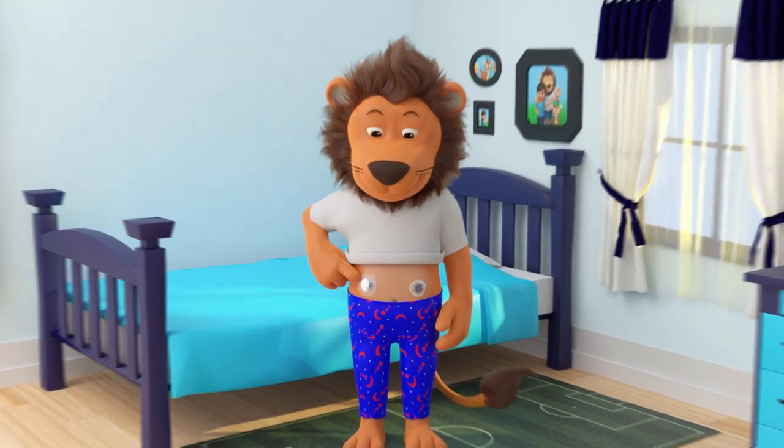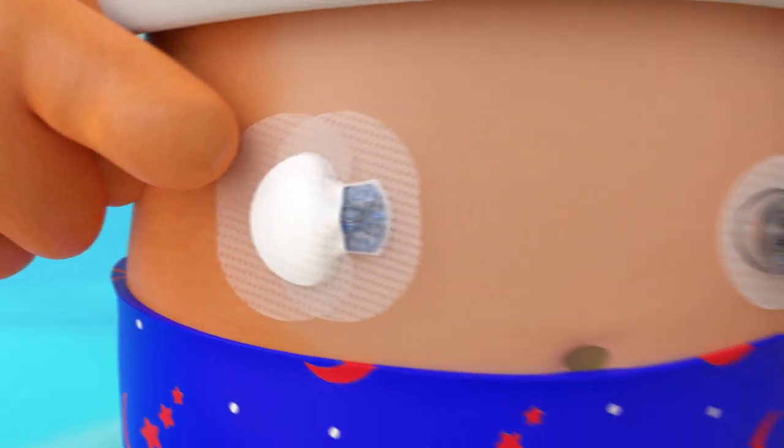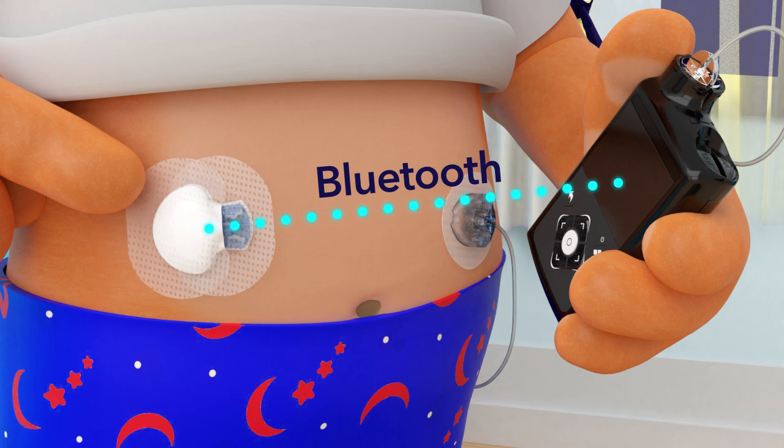Oh, I see! You have to wear a sensor on your belly, and it is the sensor that is taking your glucose readings. Just like you can talk to your friend using the phone, the sensor and pump can talk to each other via a special signal called Bluetooth. The sensor then sends your glucose reading to your pump by Bluetooth, and then you can see your glucose readings on your pump screen.